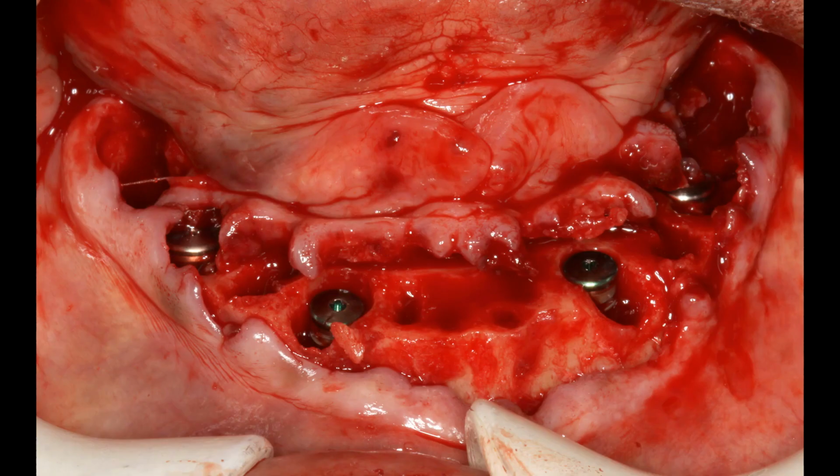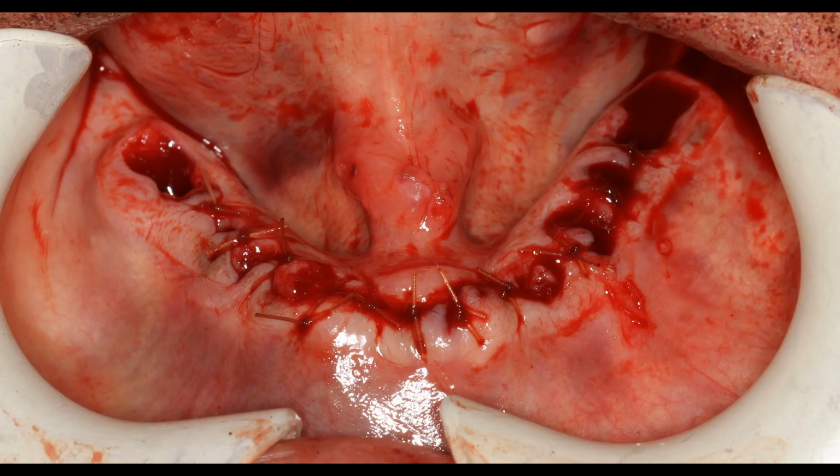Please excuse the gory slide, but I want to show you here what we do after we take the teeth out. We find ideal places, or what I call strategic places, to place the implants. On the back of his mouth, he did not have any teeth, but he did have good bone to place additional implants in the future. His implant stability was surprisingly low, meaning that the bone density was low and the connection between the implant and the bone was not real solid. So I was unable to give him fixed temporaries that day.